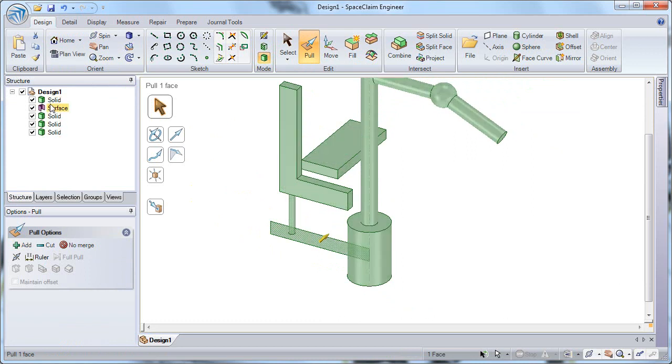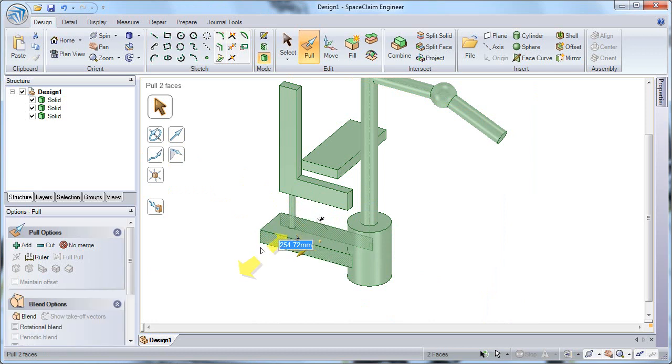so you can see the various solids that I've created. We'll select on that surface, choose Pull Both Sides from my tool guide that pops up above my mouse cursor, and when I pull that on both sides, you'll notice that what happens in my structure tree is that it merges with the other solids that it intersects with.